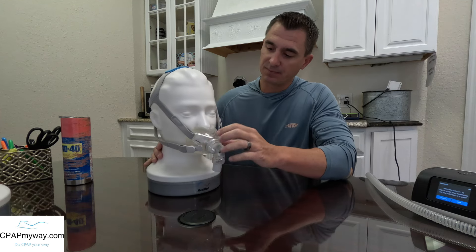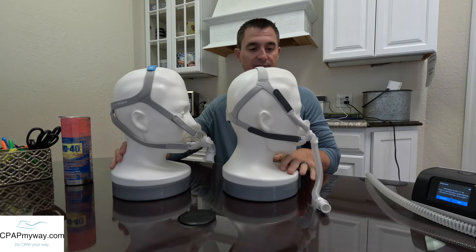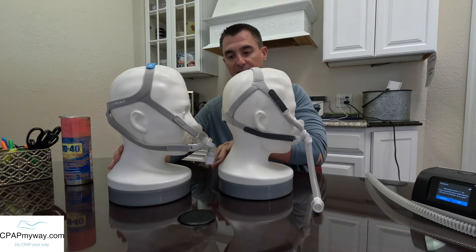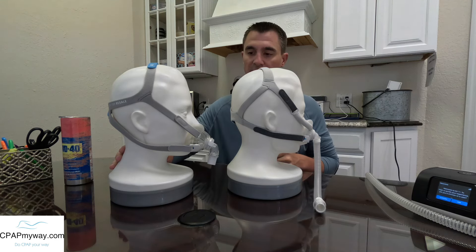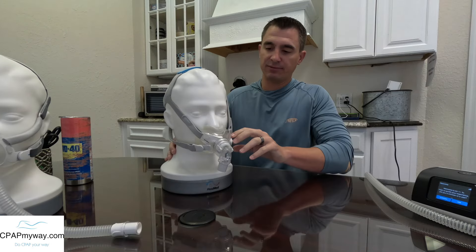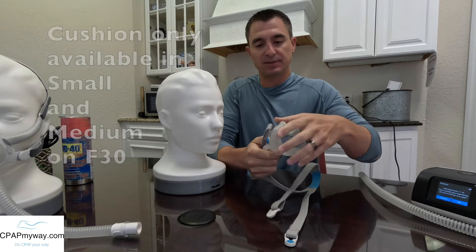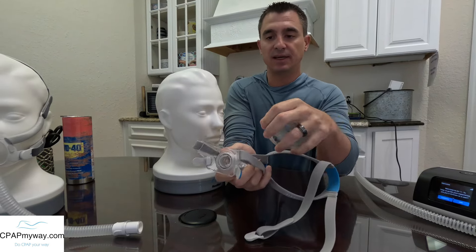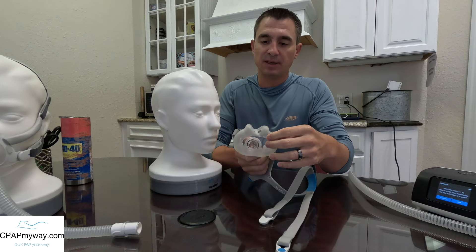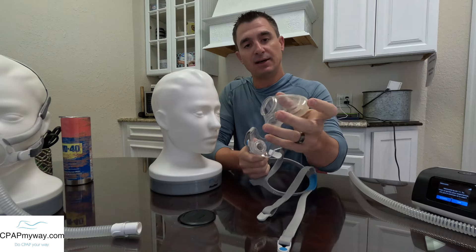First off, I want to start with the seal. Before I even get to the seal, I think it's imperative to look at how they both line up as far as how far they stick out — that's a big part of sleeping on your side, how far you can turn before your mask hits the pillow. The new F40 is much shallower and a lot of that is due to the cushion. On the F30, the cushion snaps in and out of the frame. It is a hard plastic cushion and a hard plastic frame — they lock together. It is rigid, a very firm cushion backed up by that hard plastic piece.